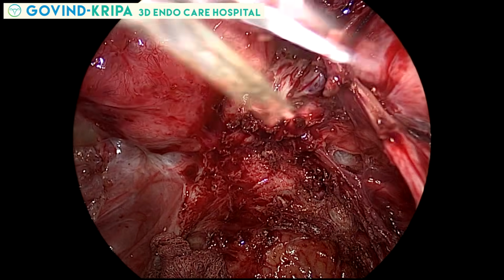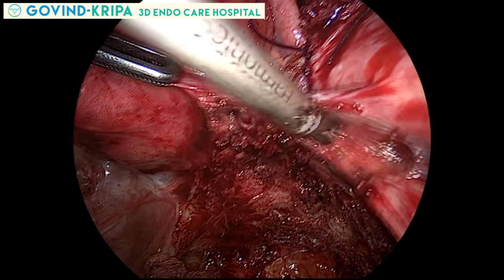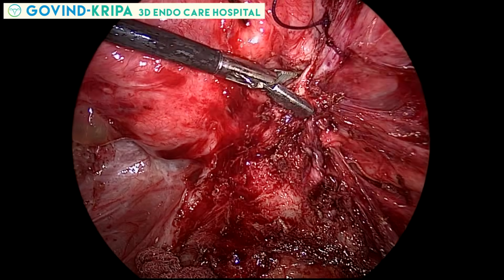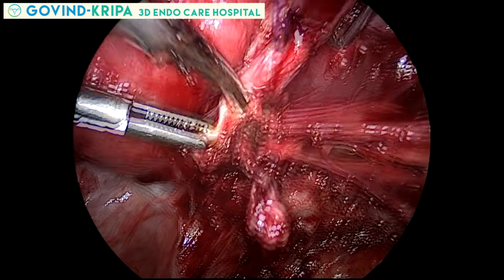Small pathological peritoneal implants around the ovarian fossa are identified, and this peritoneum is stripped off from the underlying structures. These small areas are often missed during this surgery.